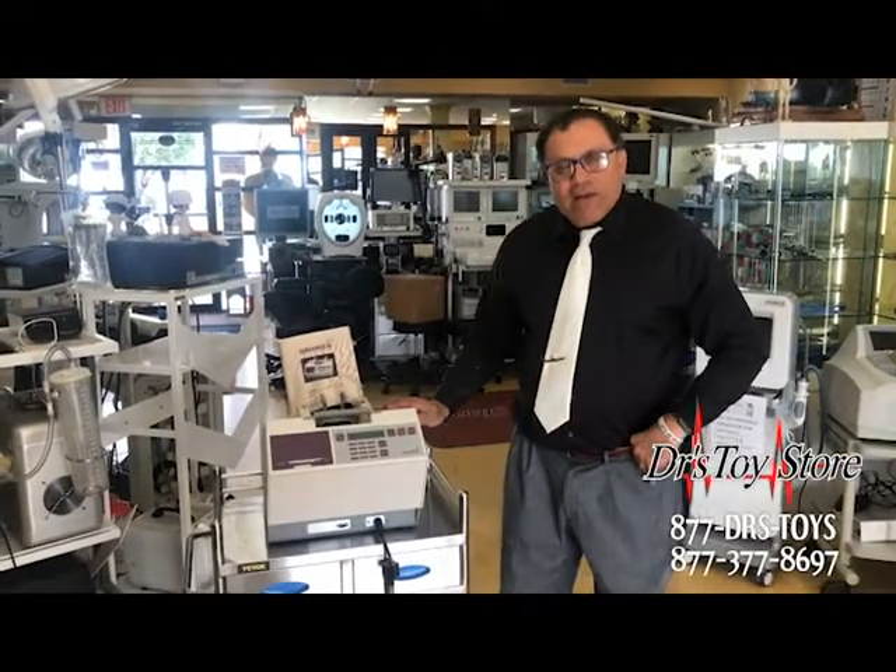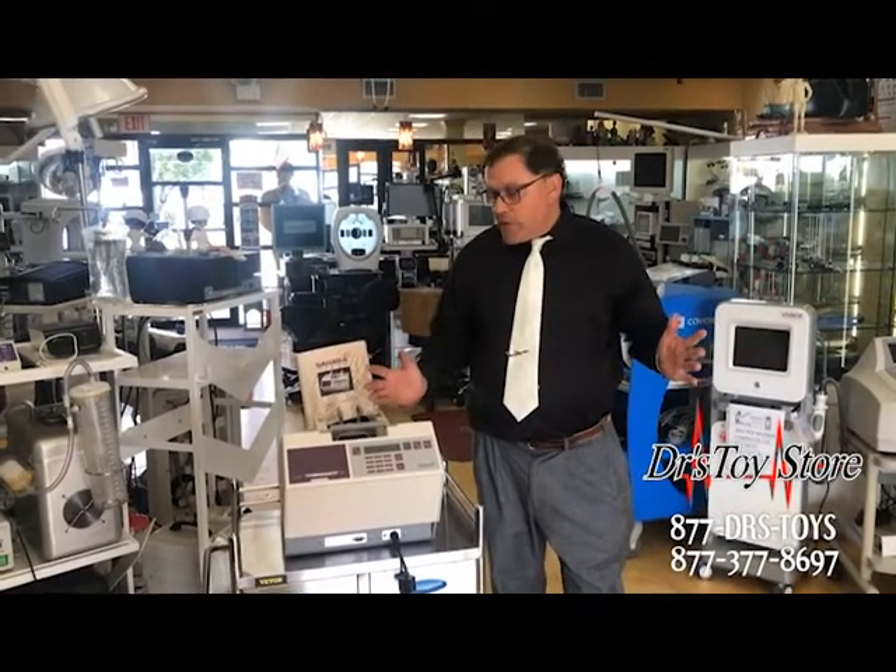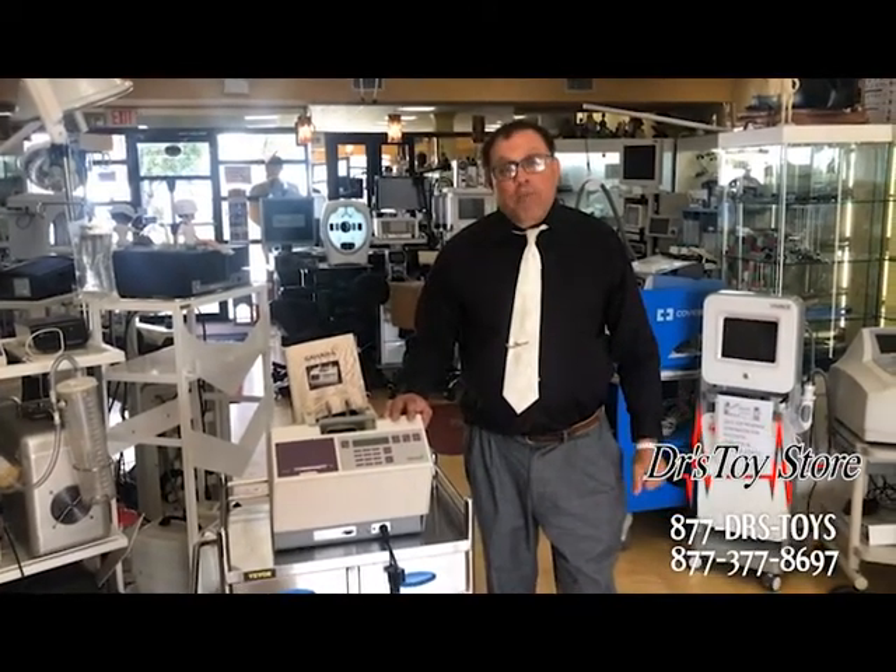This is a Sahara. It's a foot scanner. It's great for OB-GYN, family practice, fairs — anyone that's trying to raise awareness for osteoporosis.